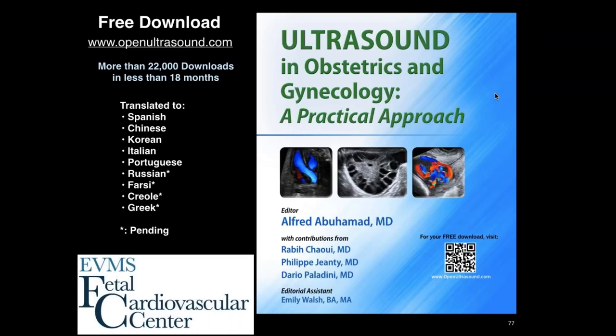What is the earliest gestational age where it's safe to use color or power Doppler to evaluate the fetal heart? There are documents available on the AIUM website and also on the ISUOG website that talk about this. We try to avoid pulsed Doppler in the first trimester because of the increased focused energy on the fetus. Color Doppler in a short amount of time is safe and has been deemed to be safe, and you have to weigh the risk-benefit equation.